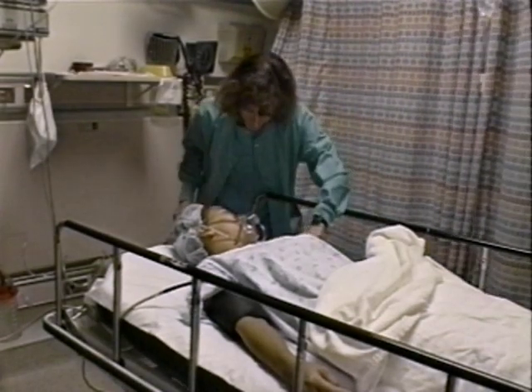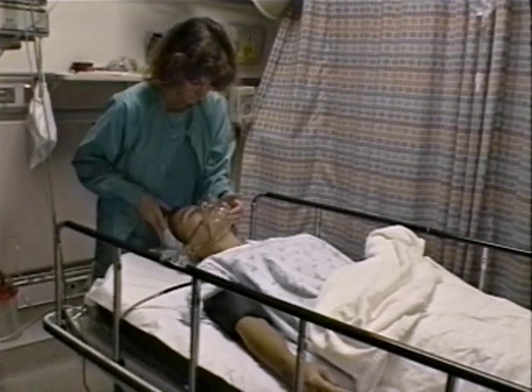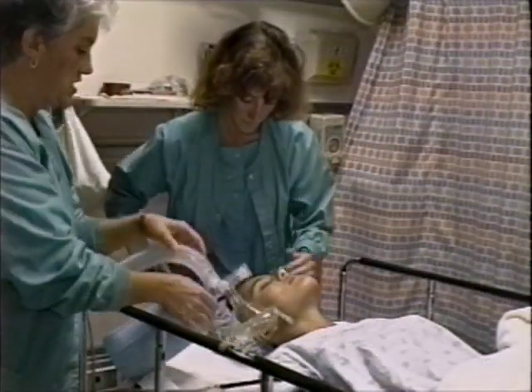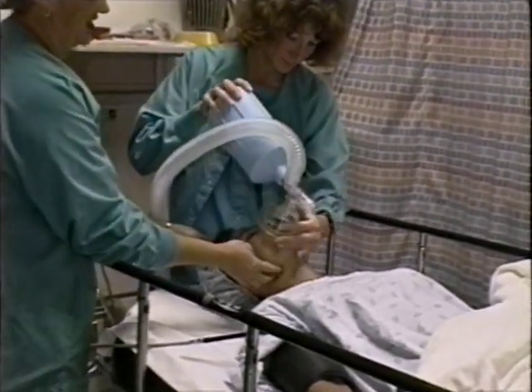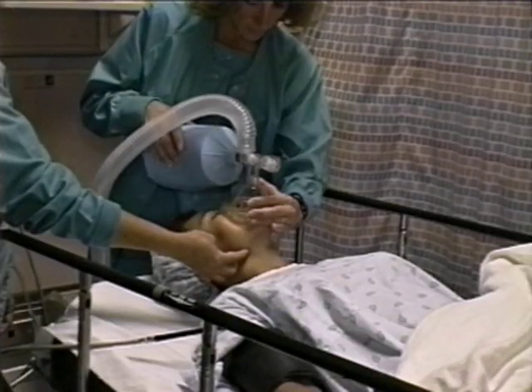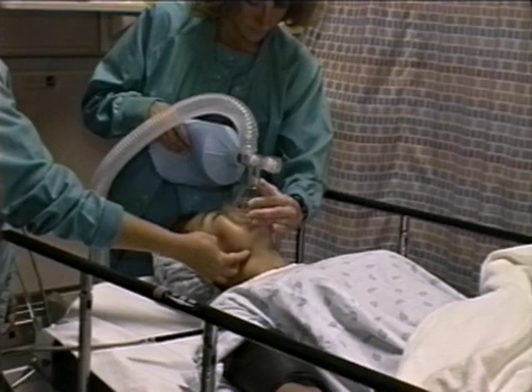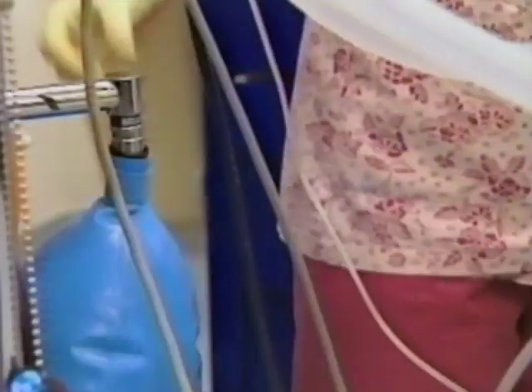After opening the airway, check your patient's ventilation. If the patient still isn't breathing well, you should immediately assist or control his respiration. Mouth-to-mouth ventilation is one option if you don't have specialized equipment. Here, we'll discuss the use of a bag valve mask apparatus. There are different types of bag valve mask devices. Here, you will see ventilation with either the typical Ambu type bag or with an anesthesia machine circuit demonstrated.